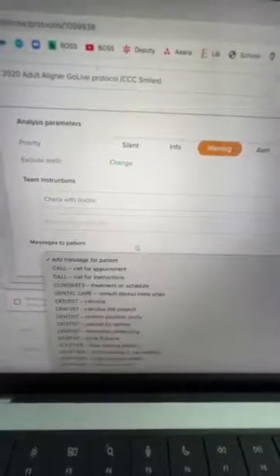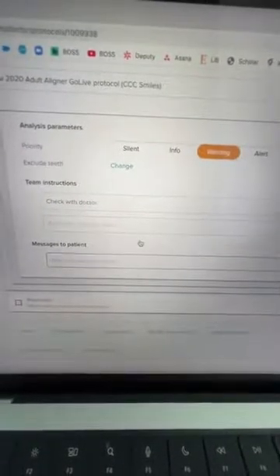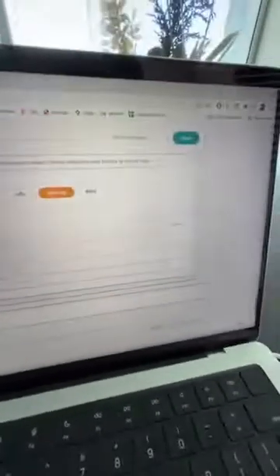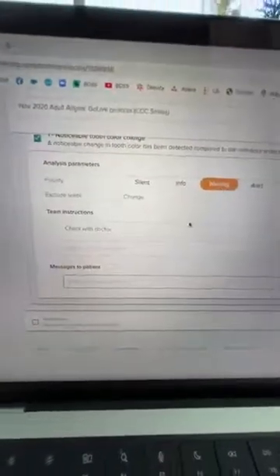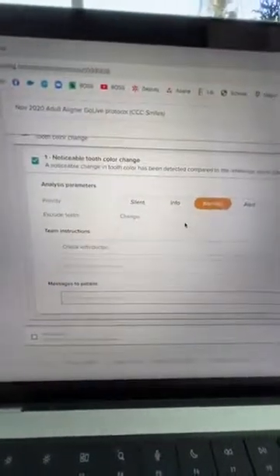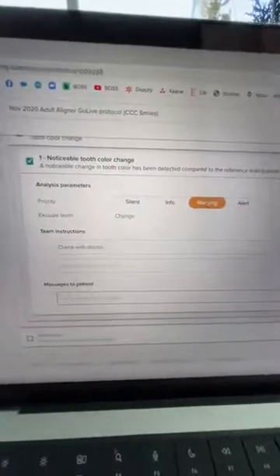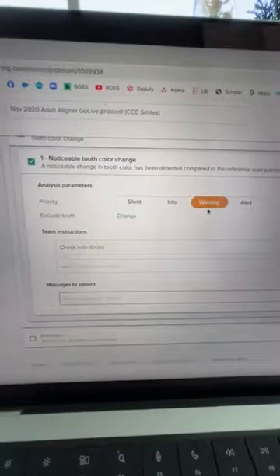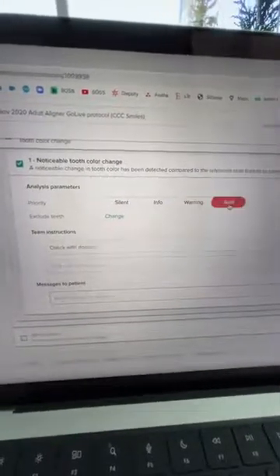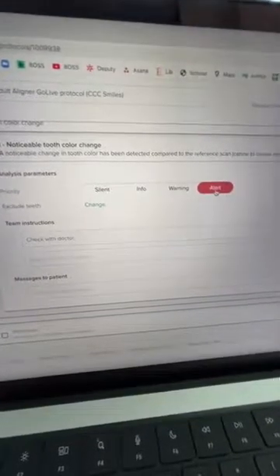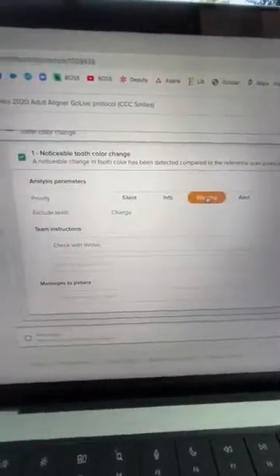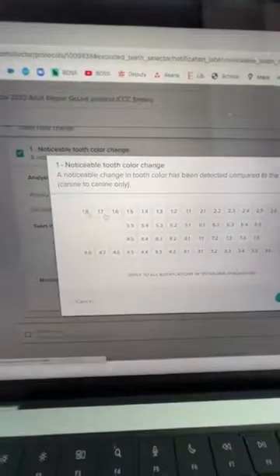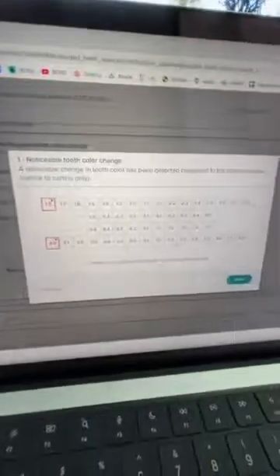I want to be warned that a tooth color has changed. We're not going to send any message to the patient because we don't know if this needs to be investigated. My team will actually now, if I set this parameter and I go save on this protocol, anytime there's a noticeable tooth color change during orthodontic treatment at any scan I will get an orange alert in my dashboard, which means it's important. Red alert is attend to it now.